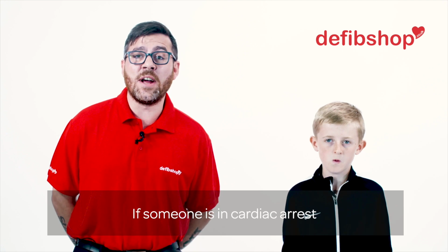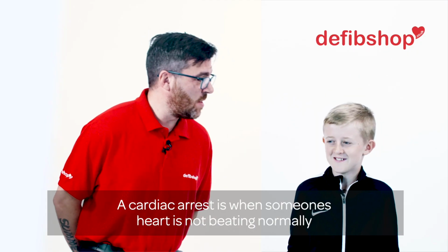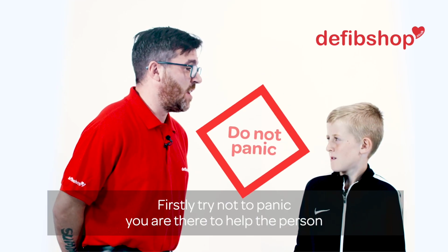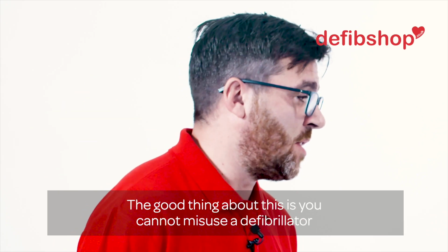If someone's in cardiac arrest, the only thing that's going to help them is a defibrillator. What's cardiac arrest? A cardiac arrest is when someone's heart's not beating normally and they fall unconscious and they're in trouble. What can I do? First, you try not to panic. You're there to help the person. What happens if I get it wrong? The good thing about this, you cannot misuse a defibrillator.